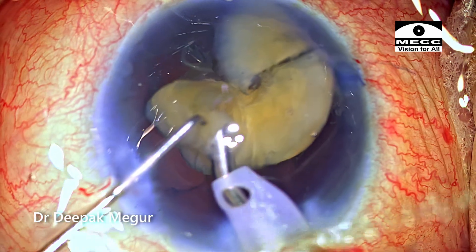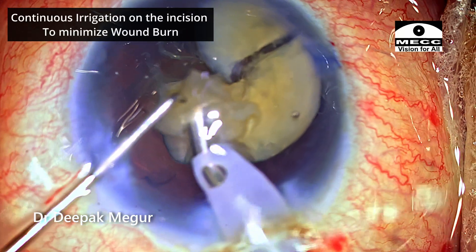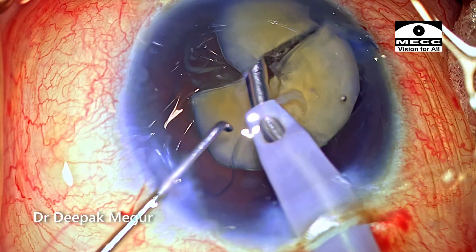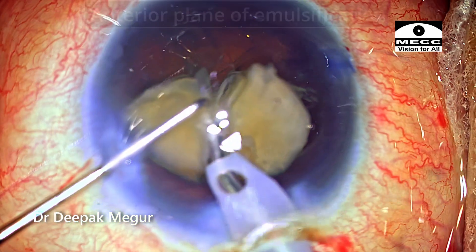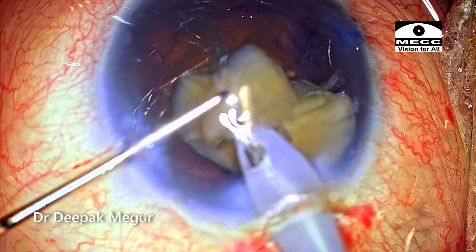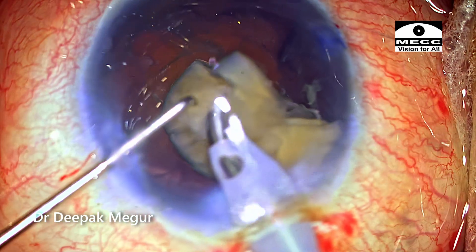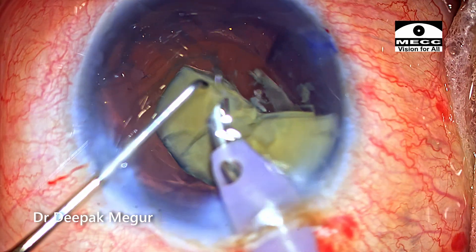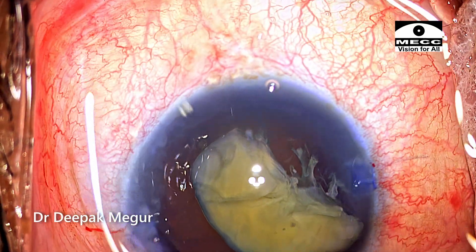I'm consciously emulsifying these fragments in the anterior chamber and to prevent endothelial damage I've coated with a copious amount of OVD just to protect the cornea. There are certain situations like these where the capsular bag is very flimsy — these are situations where I would recommend an anterior plane of emulsification. These are compromised capsular bags so I don't want to exert any stress on them. The OVD is being constantly replenished, and now I have the second hemi-nucleus remaining to be emulsified.